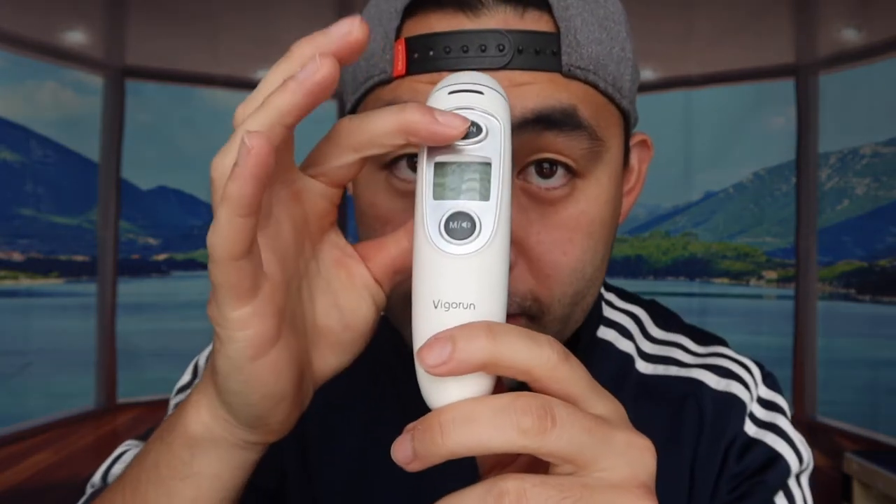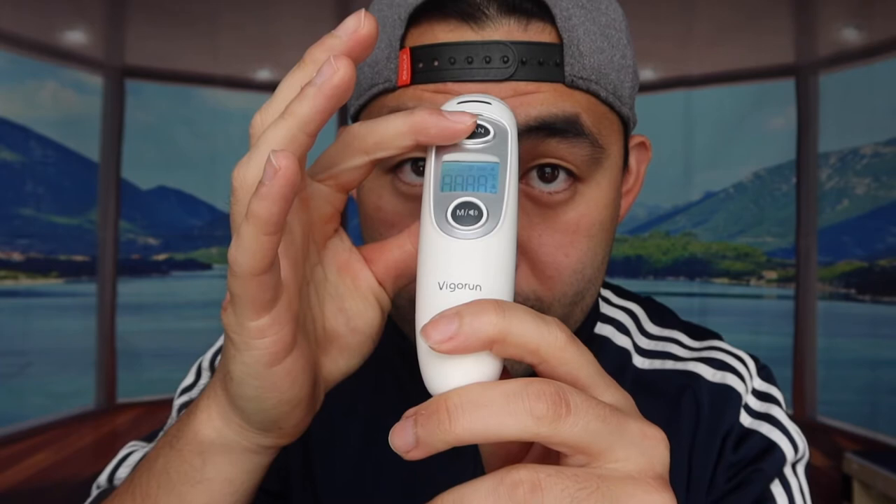This last thermometer also comes with an instruction manual and a carrying bag, which is nice for portability. It has a button to activate it and it's also an infrared model. Same recommendation applies: remove the cap for the ear option and use a probe cover. For the forehead, just press the button and hold it near your forehead — it reads 97.1. This one also uses two AAA batteries.